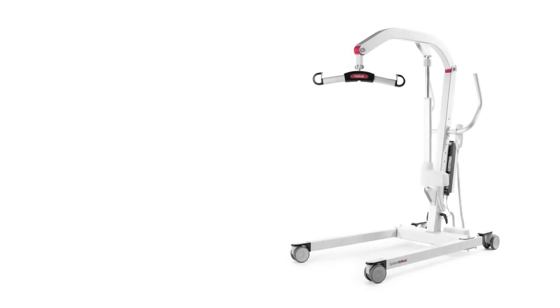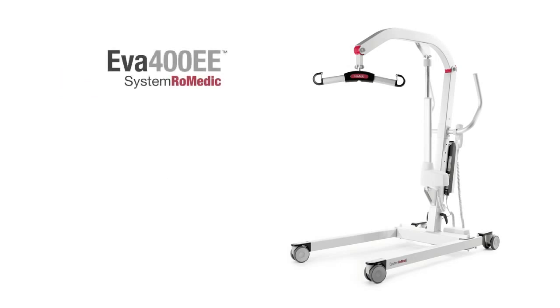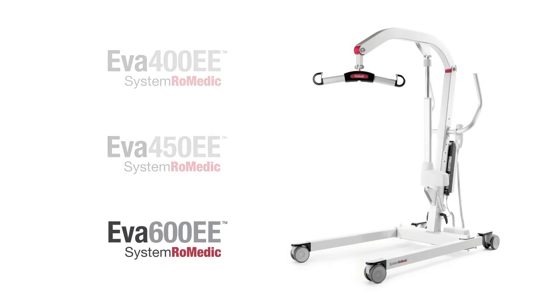In this video, we will discuss the operation of the Eva lift, including assembly, operation, safety checks, troubleshooting, as well as care and maintenance. SystemRoMedic includes 3 models with a weight capacity of 400, 450, and 600 pounds. The Eva lift is available with electric boom and electric leg widening. In this video, we will primarily discuss the Eva 600 EE, and we will demonstrate the various slings and accessories, including the ambulation arm for gait training.